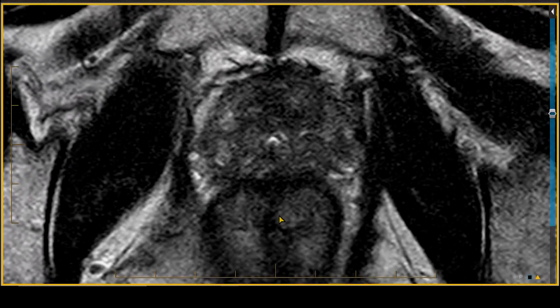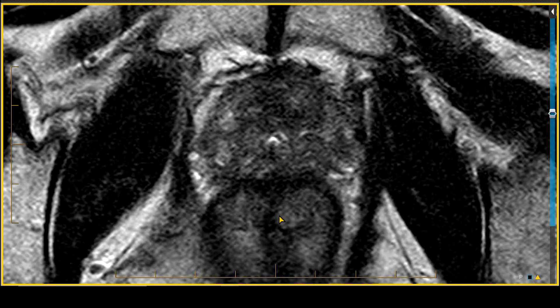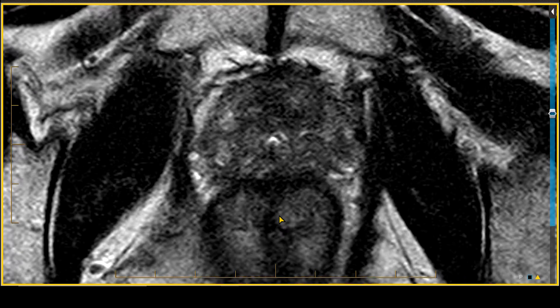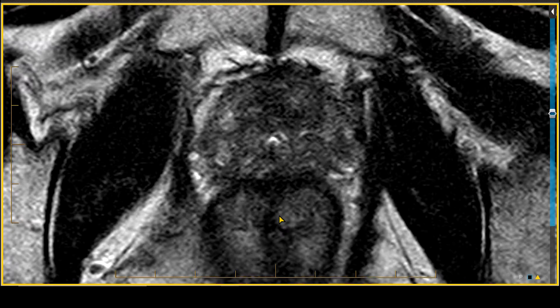This next multiparametric MRI case of the prostate shows the value of multiparametric MRI for a patient in active surveillance for low-volume, low-risk prostate cancer such as Gleason 3 plus 3. This patient is a 70-year-old male diagnosed with low-risk, low-volume Gleason score 3 plus 3 prostate cancer, also called grade group 1, with transrectal ultrasound guided biopsy, and was being followed with active surveillance.